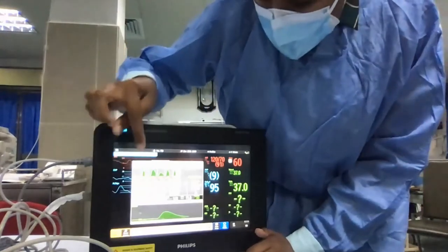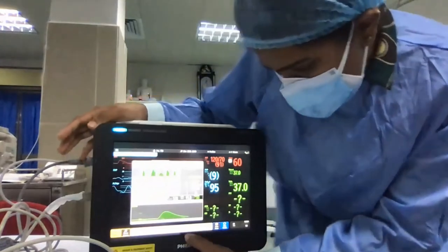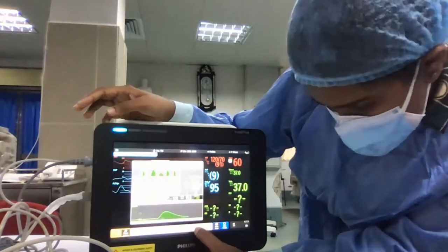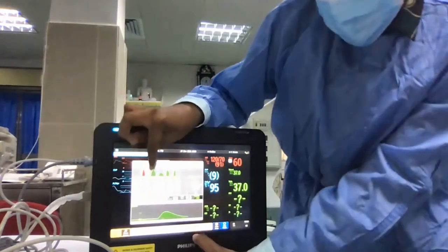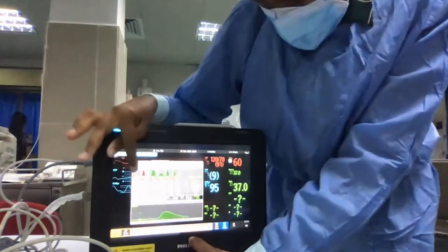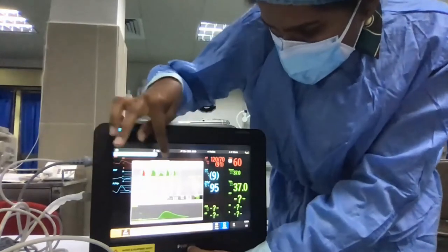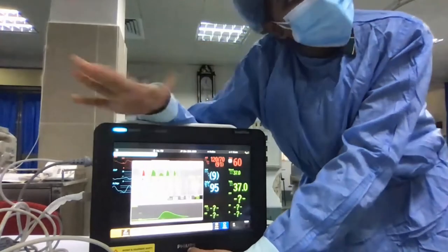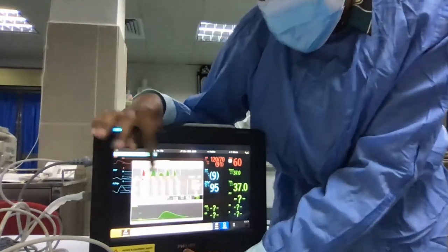So you can anyway ask it from the monitor as well. If you select trial, click on accept and reject, and the monitor will show you which measurement to be deleted, like to reject. Or else you can do it manually as well. So I will just select this one. The ones that turn red will be automatically rejected, deleted. It won't be taken into the CCO calibration.